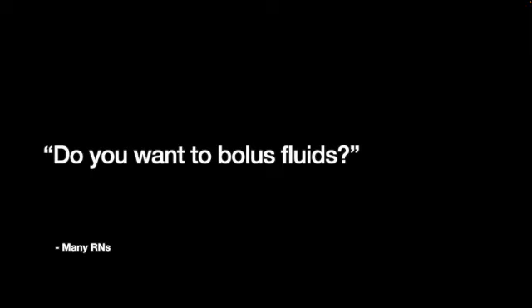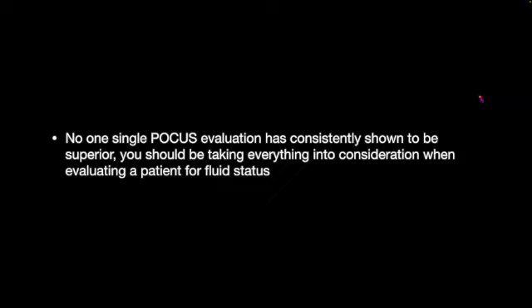All right, this is such an important question. Many RNs and other doctors, and even us, we ask ourselves this: do we want to bolus more fluids in our patient? Let it be known, like I had told you before, most of the time you need to do multiple point-of-care ultrasound examinations to get the information you need.